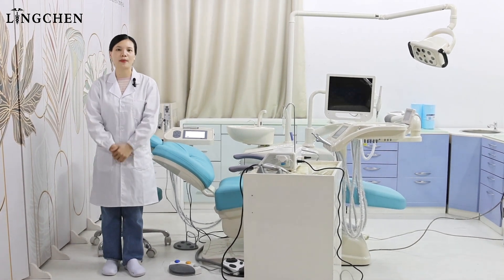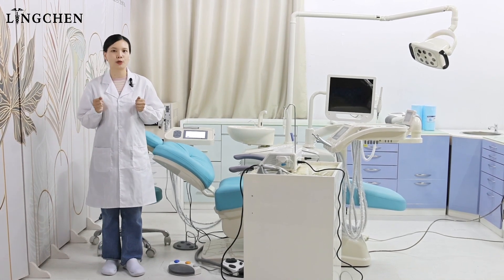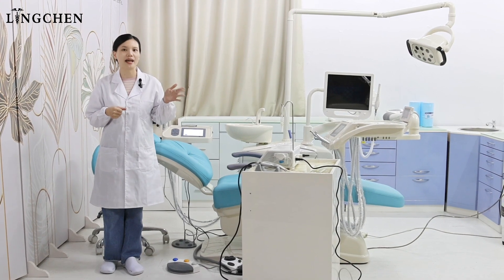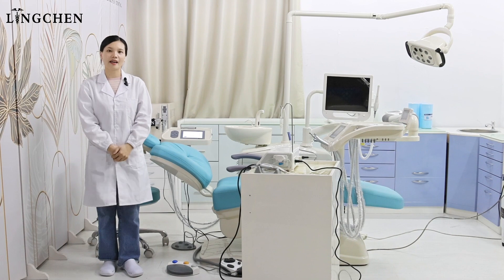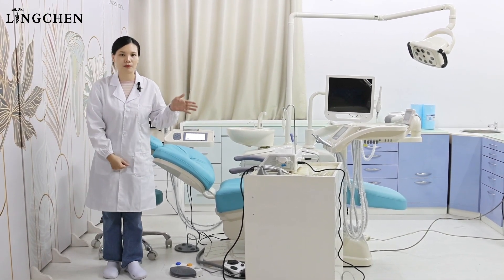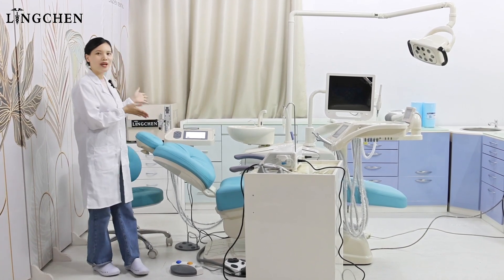Linchen keeps developing the dental chair with multi-function. We have succeeded in producing the dental chair with the built-in microscope, built-in x-ray, and built-in endopax. There are many dealers and dentists requesting the implant dental chair from us. Now, it is ready here.